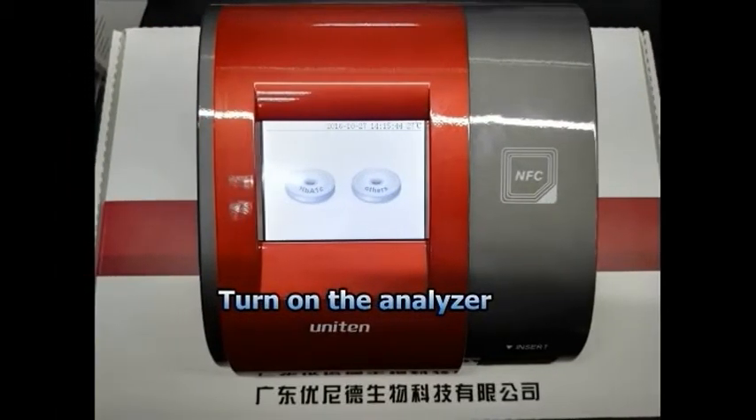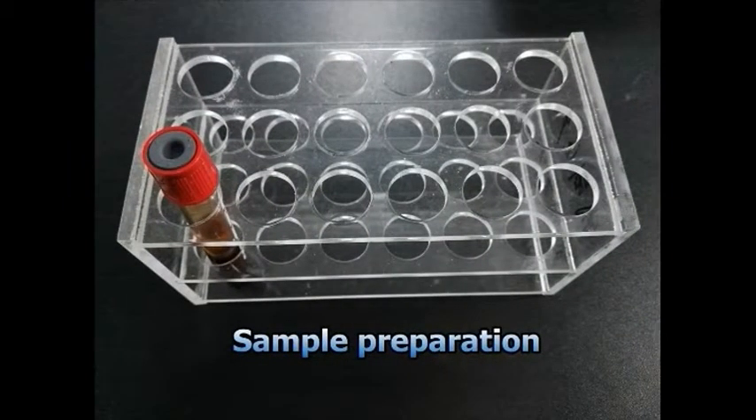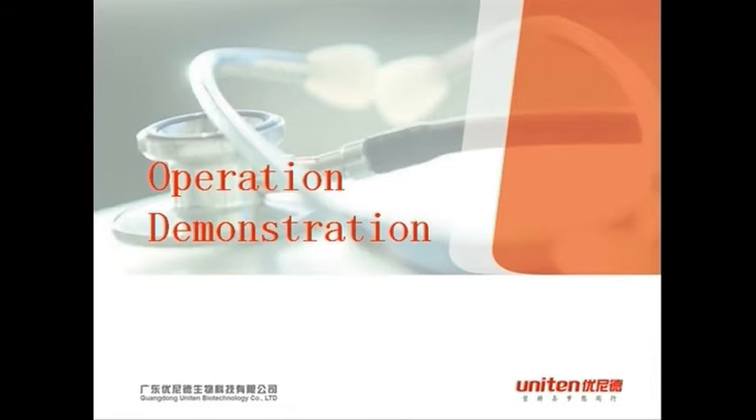Turn on the analyzer. Sample preparation uses finger prick blood or venous whole blood. Operation demonstration follows.